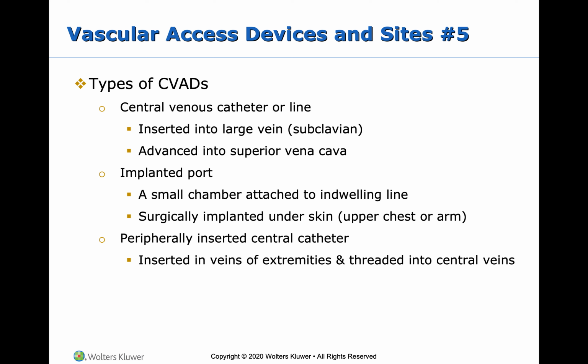So in your book, it tells you that for the discard tube, you're going to need 2 times the dead space for non-coag specimens and 6 times the dead space for coag specimens. But like I said, 5 milliliters is safe for any specimen, coag or not. So if you have a hard time remembering 2 times the dead space and 6 times the dead space for coags, just remember 5 milliliters. 5 milliliters minimum, that's perfect. Okay?